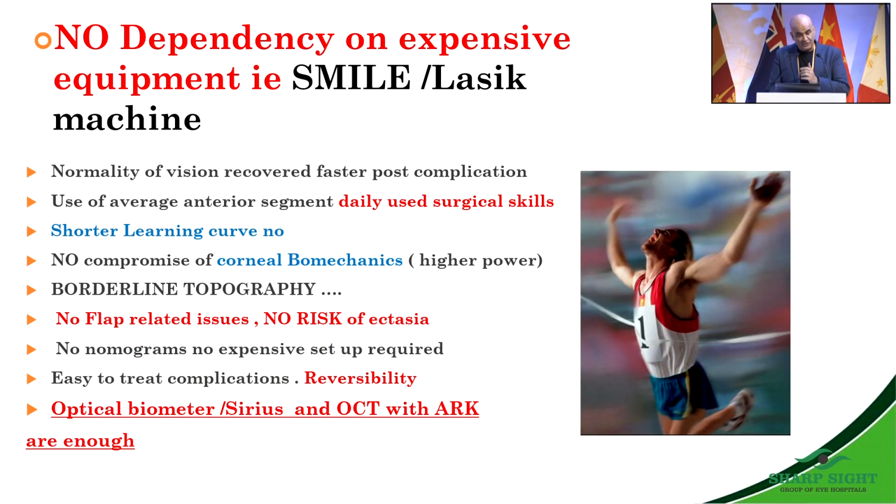There's no dependency on heavy-duty machines, no borderline topography. All you need is just an optical biometer or a simple topographer. And in case you don't have access to that, let's see what else we can do for these patients.